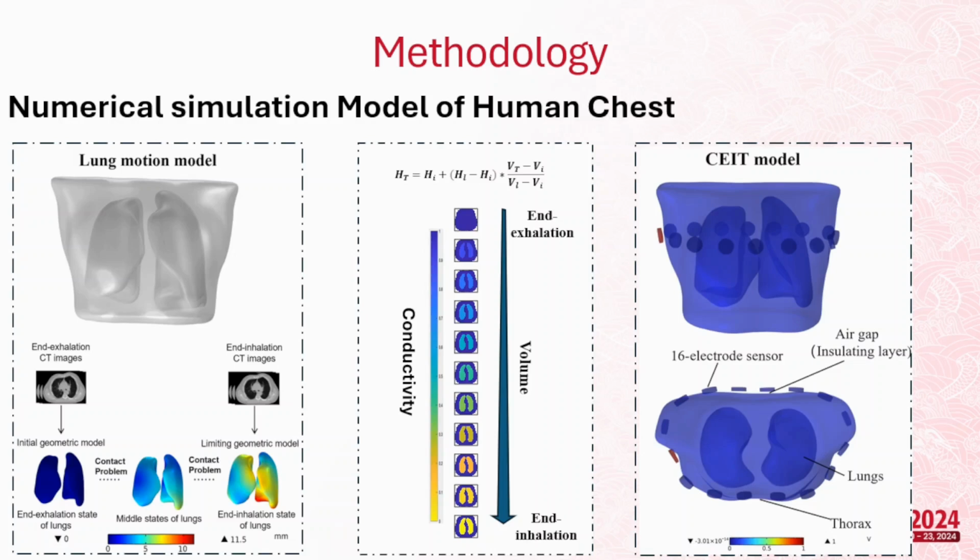So we prefer to do this in a digital twin. We might also need some CT labeled data fused together with the digital twin model to do the work.